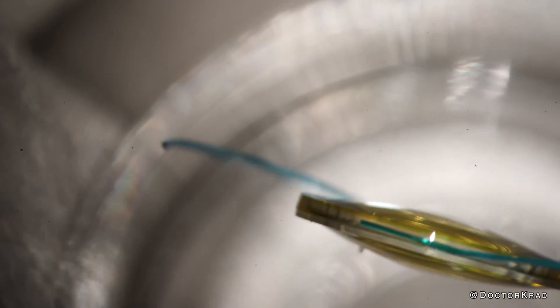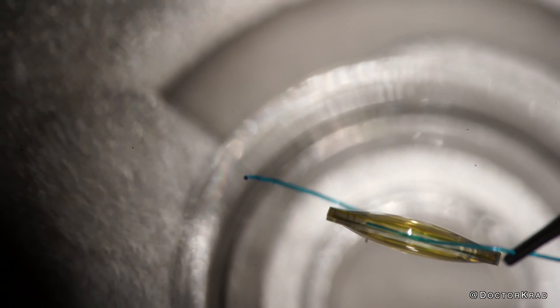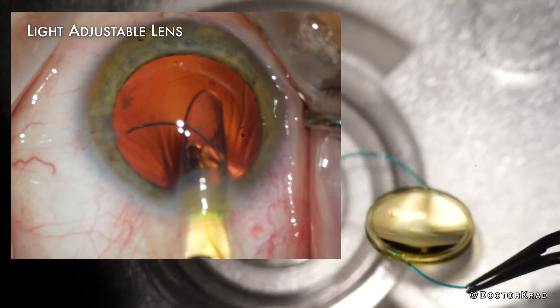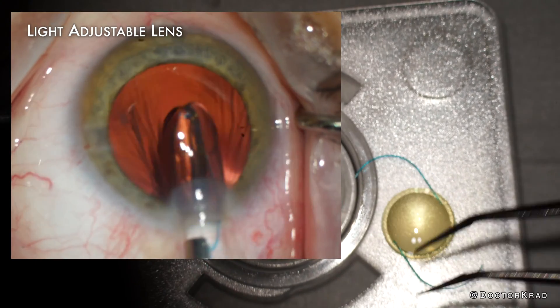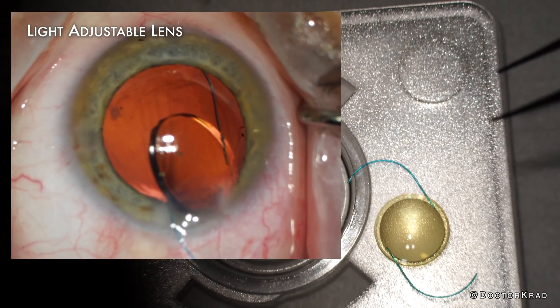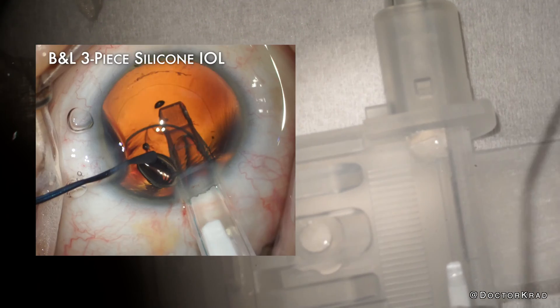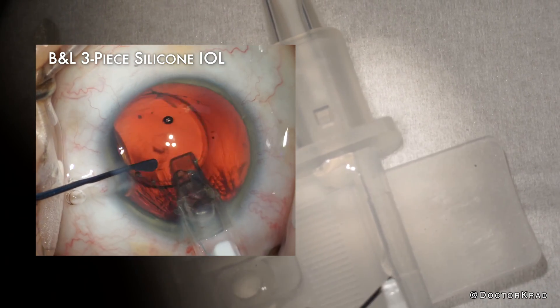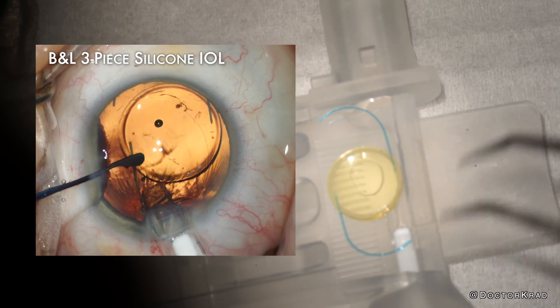While the light adjustable lens is the most precise monofocal lens out there, it is notorious for coming out of the injector in a vertical cartwheel fashion. This is due to the design of the injector. I recently implanted another three-piece IOL made of silicone with blue PMMA haptics, made by Bausch & Lomb, and it came out of the injector in a very planar, flat, safe fashion.